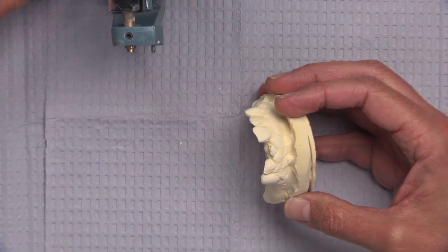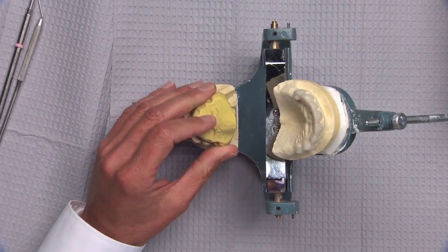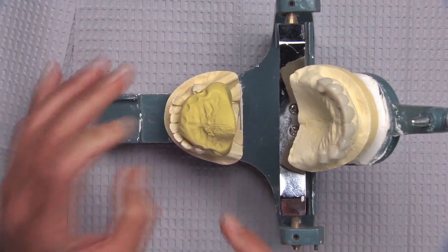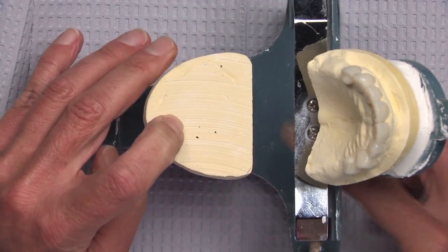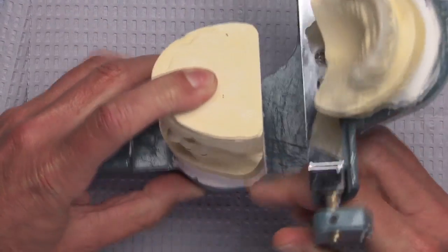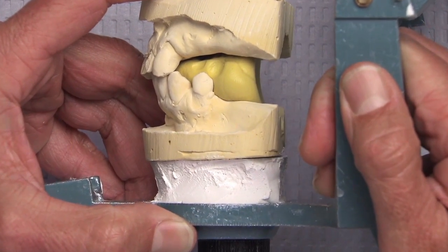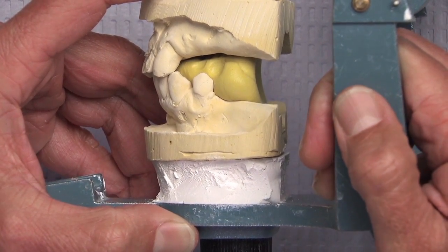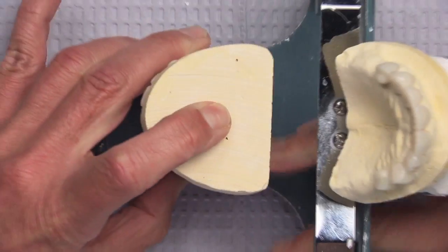Once we do that, we take and make an index record of that position. We take some impression putty — the same kind I just mentioned — and once we have the models mounted on the articulator, we push the impression putty in between the two arches and up against the palate to support it, once we've determined the correct position and the correct vertical for where those edentulous ridges should be.